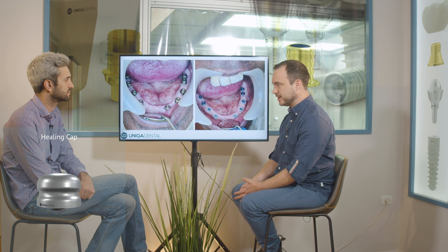All the scan abutments are at the multi-unit level. We screwed these abutments and inserted multi-unit healing caps on top until the bridges are ready.